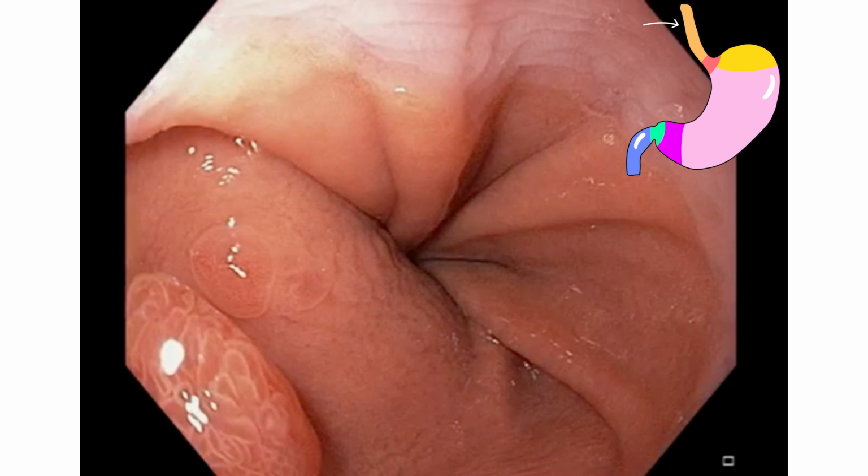This yellow liquid you see all around the intestinal walls is bile. This bile is evacuated here to help digest the fatty compounds from the ingested food. After that, we will gently pull out the endoscope, we examine the intestinal mucosa once again, and we return to the stomach, passing through the pyloric sphincter. Then we will perform a U-turn move so we can clearly see the fundus region. We inspect this region especially in patients with cirrhosis for gastric varices. Now we will simply return to the normal position, and we will finish the procedure by meticulously inspecting once again the stomach and the esophagus.